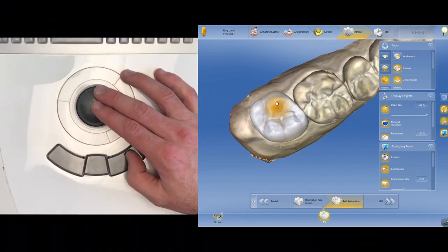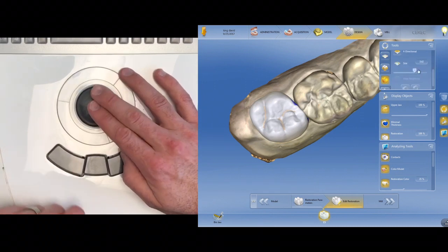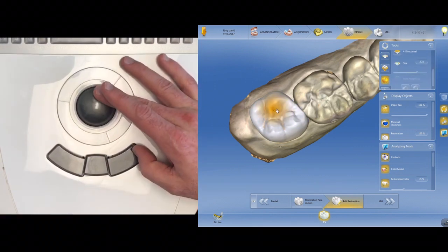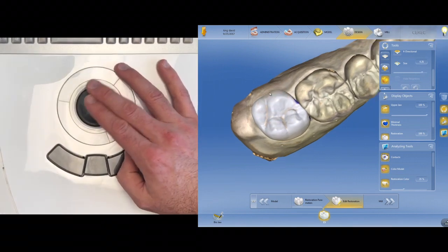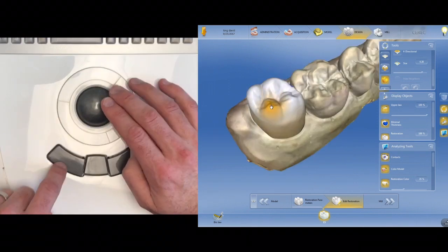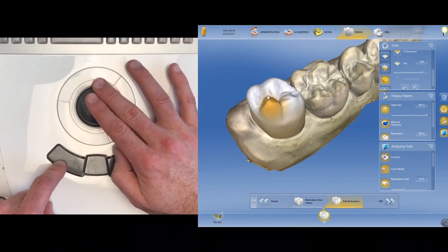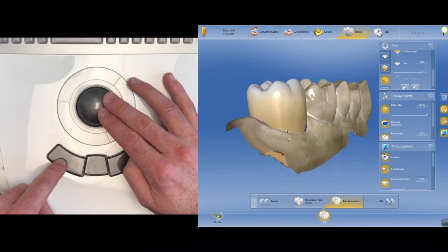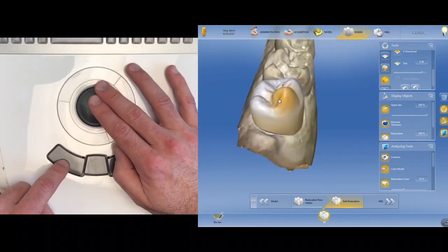So a right button, increasing the size of the tool, and you can also get to that over here. You can see now, watch the size up and down as I use that right button. Okay, and then if I use the right button off of the model, it's panning. Now the left button is actually going to make changes, right? So as long as I'm on the model or on the restoration, it's going to make changes. The moment I'm off the restoration now, it's going to rotate. Same button.